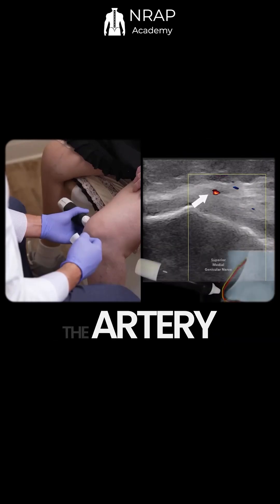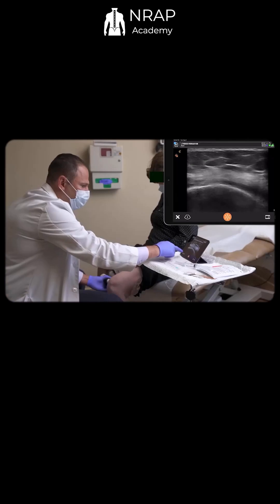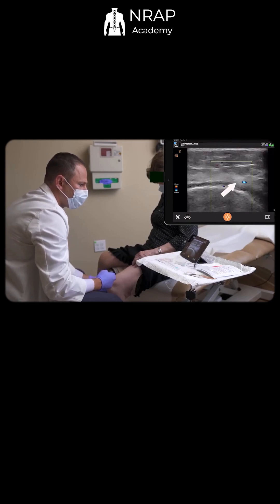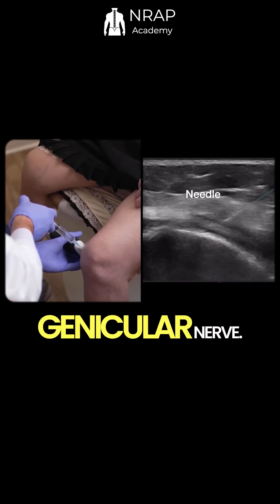The nerve runs along with the artery, close to the epicondyle. Scanning distally, the nerve approaches the corner of the epicondyle with the blood vessel. As it descends to innervate the knee, injecting one to two milliliters around the genicular nerve.